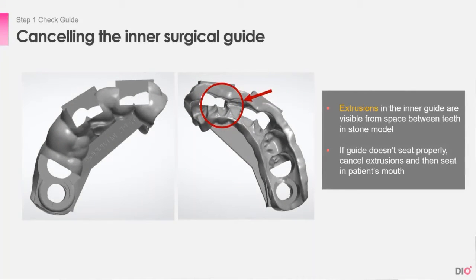This is a different case for a different patient. If the patient has a wide gap between their teeth, when the guide is produced, the gap becomes extrusions aligning to that space. This may hinder the fit of the guide, so it is necessary to delete the extrusions before seating it.